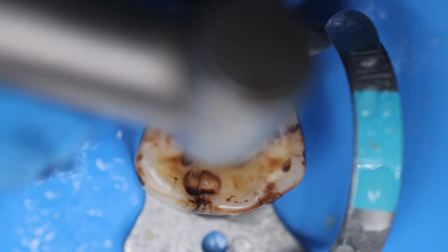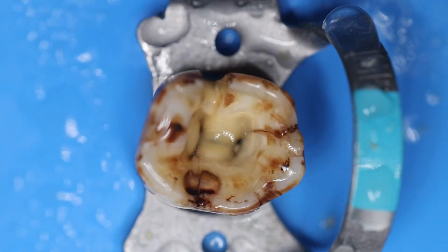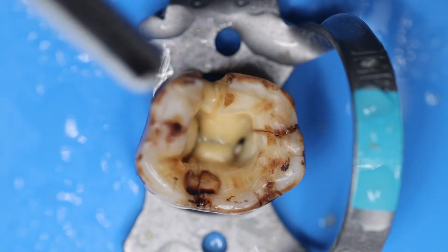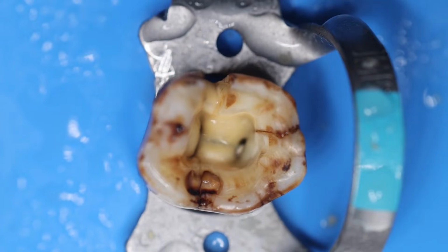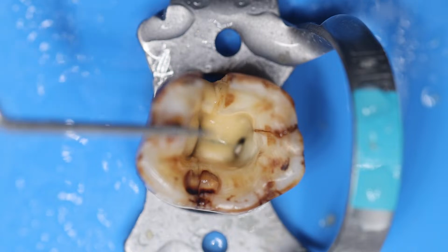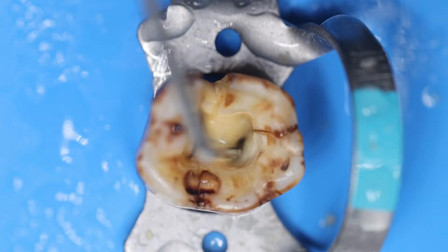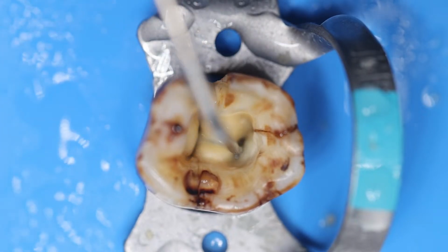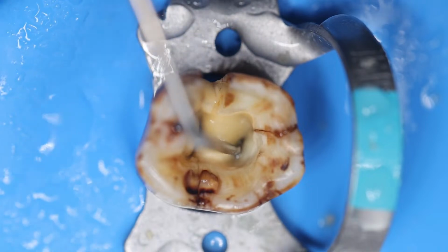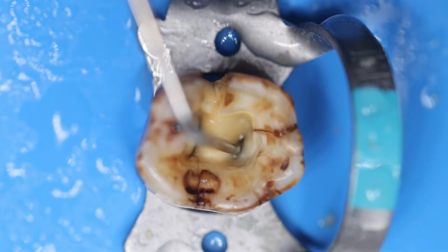Remove those areas that are just obstructing the orifices. Now once you have done this, you can just use the three-way to visualize how the orifices look that we are looking at. So now you can clearly see, use this DG16 probe over here. Always use this DG16 probe to explore these canal orifices. See, the probe will get engaged into the orifices. If that is a proper orifice, the DG16 probe will engage into those orifices.